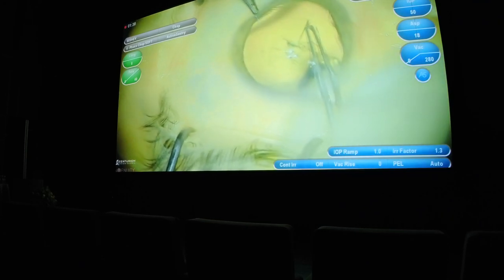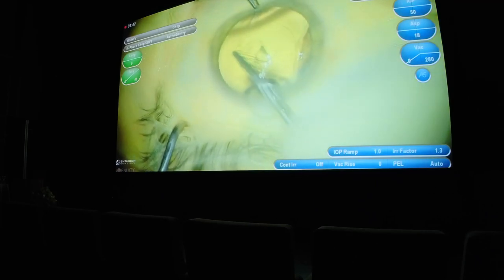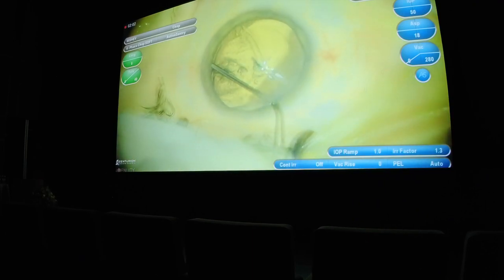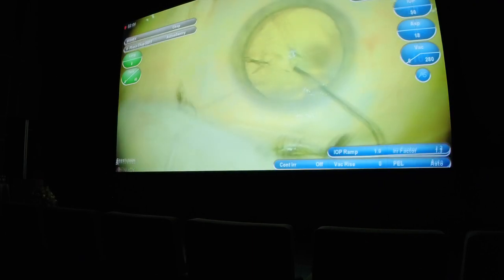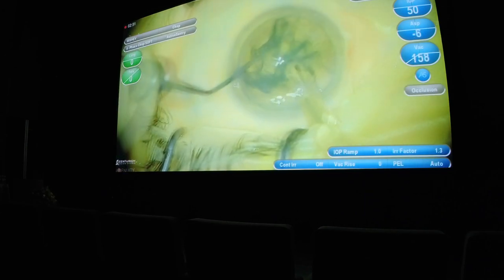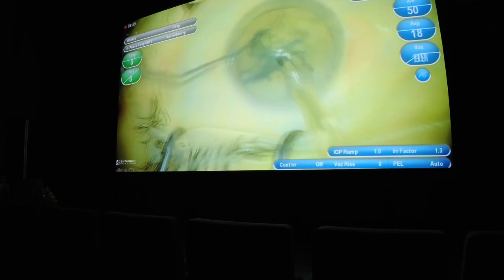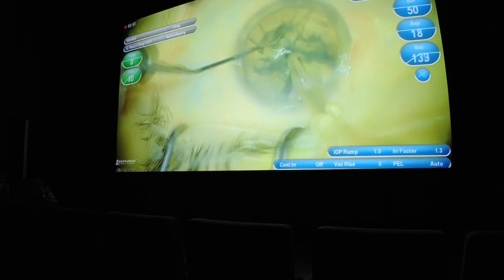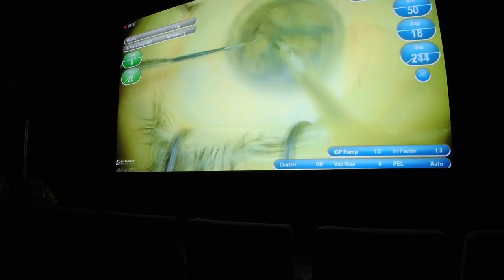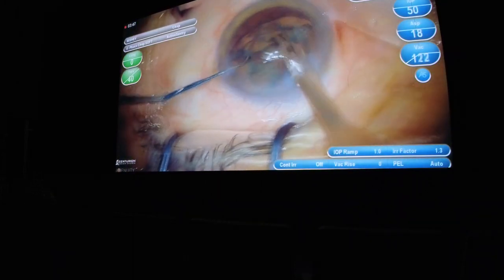This is a color filter developed by me, which is supposed to increase the contrast differences between the lens material and the capsule. You can appreciate the fluid wave, and you can see how the anterior axis was in focus and the wave which is roughly 4 mm behind the lens — so it's behind the lens. Here you can see the transparency of the pieces. And now you can see the regular image.